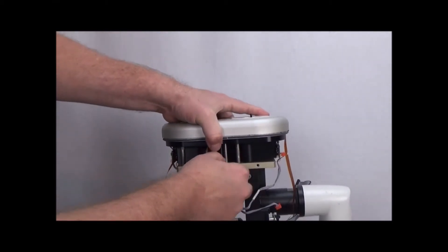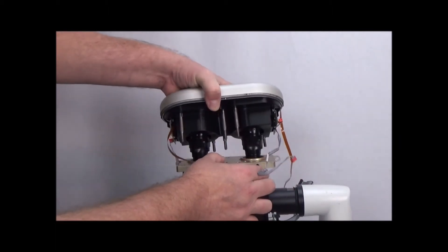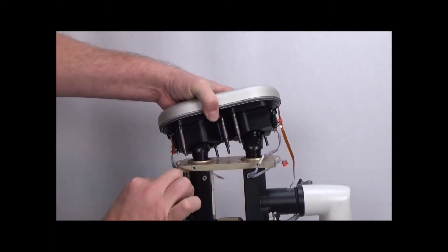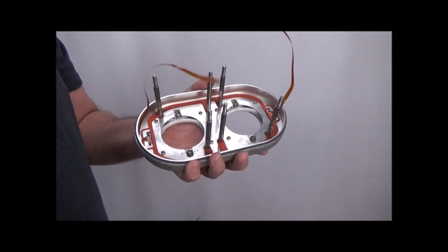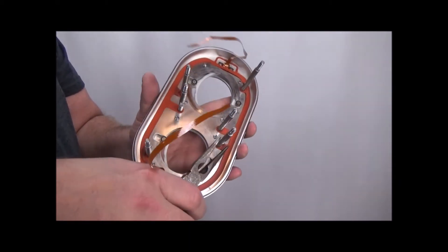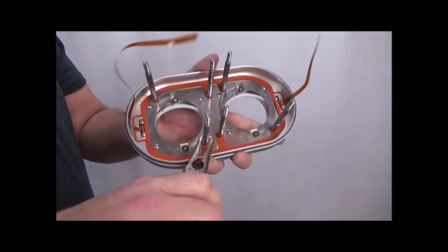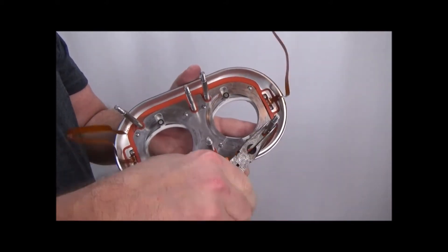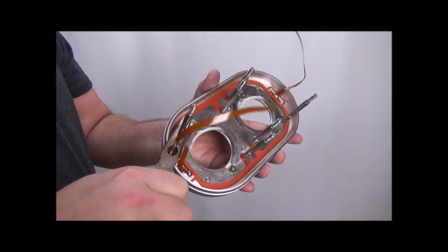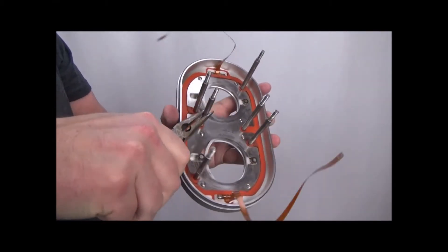Now the end cap just lifts off. I'm just going to use needle nose pliers or a wrench to loosen each one of these so we can do them finger tight.